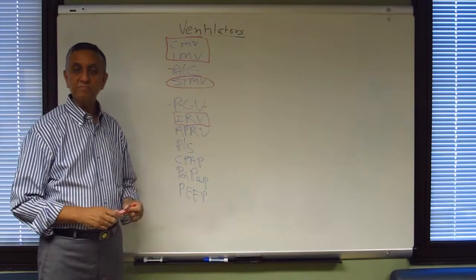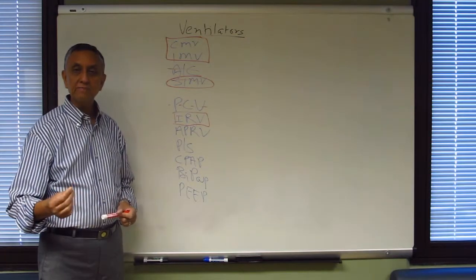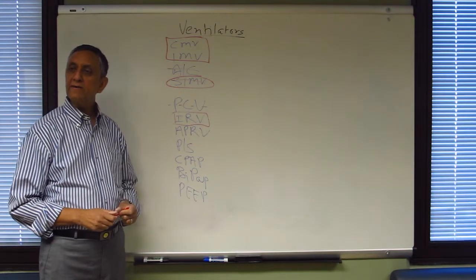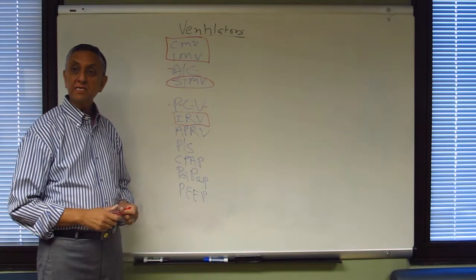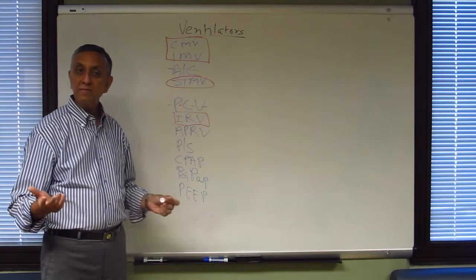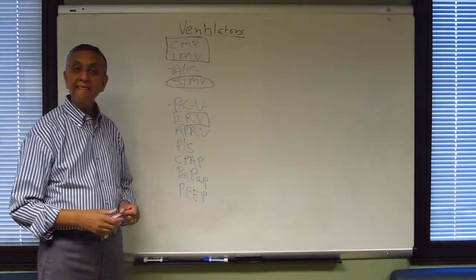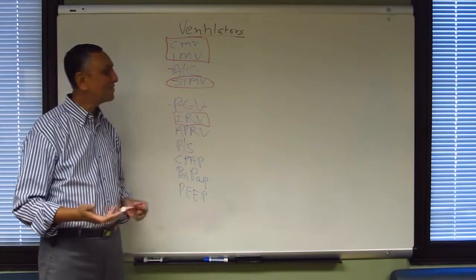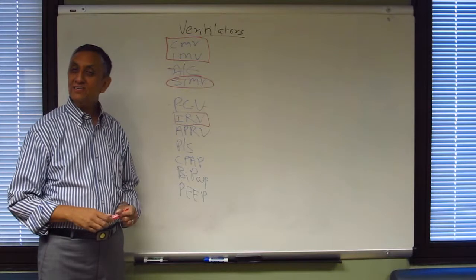Just because the patient is very sick and requires every bit that you can give from the ventilator for that PO2 or bare minimum. What's the minimum PaO2 that you would want in a critically ill patient? Any number? Any guess? At least 50. 50. 80. 60. 55. 50, 60, good. 60 is actually correct.